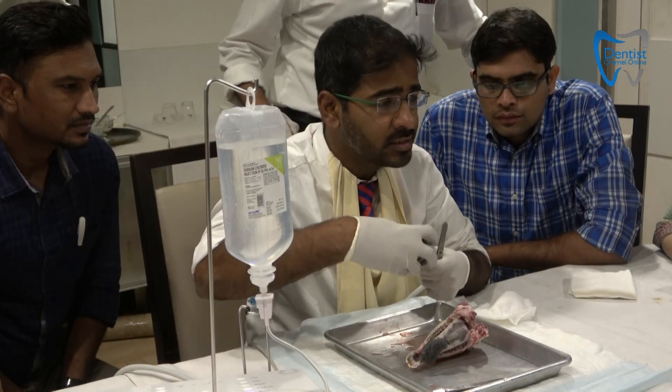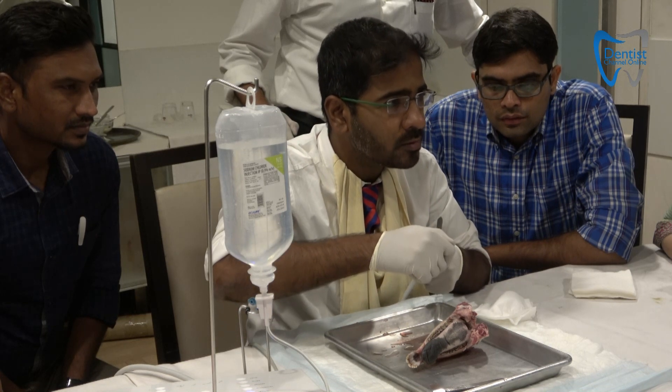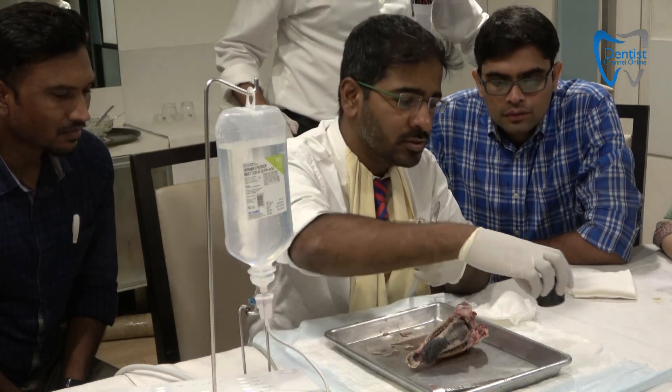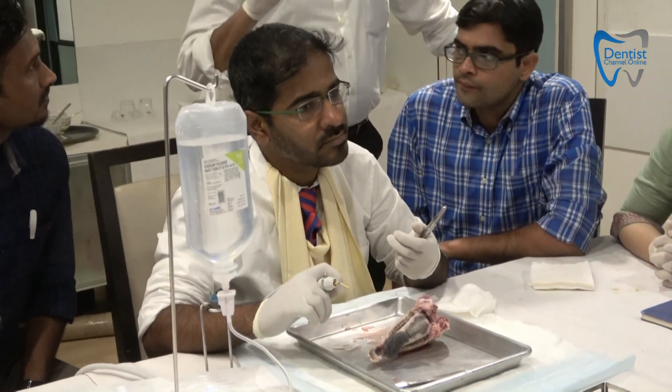You have to fix the tip — once it is tight it is functional; before that it is not functional. That is the torque ratchet for this. In case you don't tighten it, the system will tell you to tighten it.